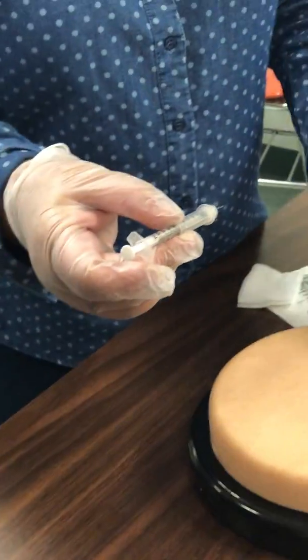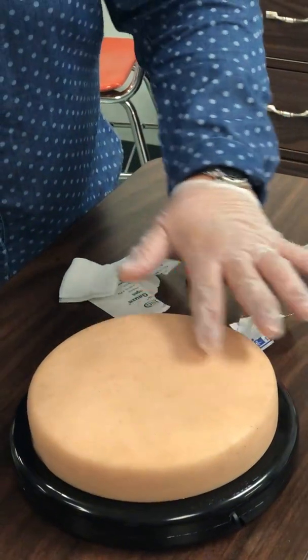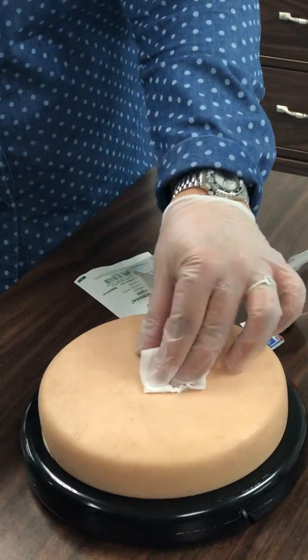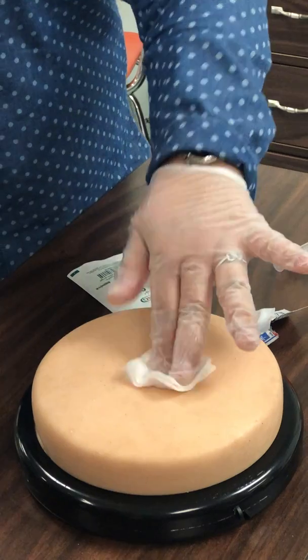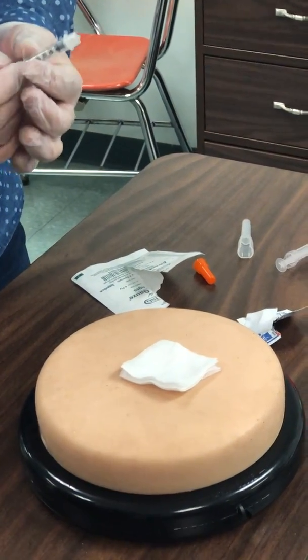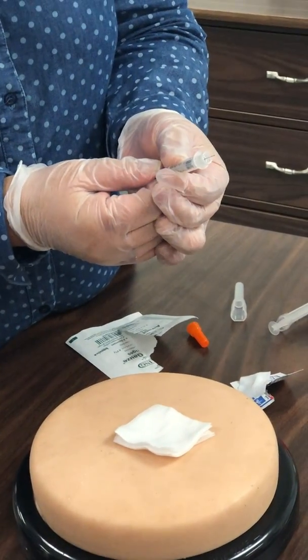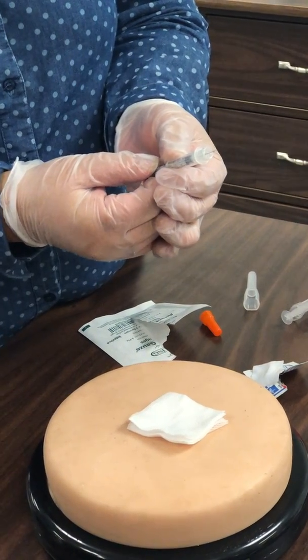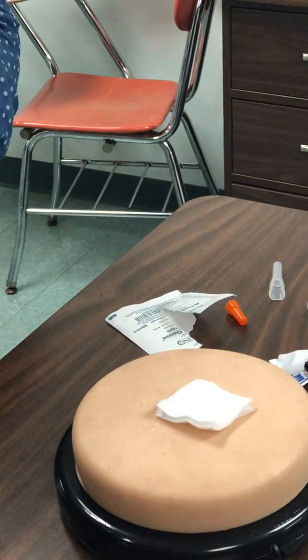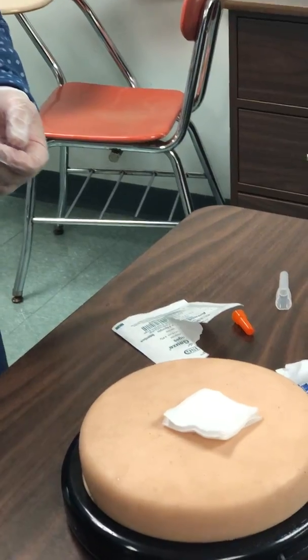Went out. That's okay. He's not a real person. Okay. It's still bleeding. All right, you cover. All right, so check if it's still bleeding. It's still bleeding. All right, so this one, the safety device here is this thing. We just push it, push it, and we have to hear the click. Right, you want to try? Just push it all the way. There, see? You hear the click, click.